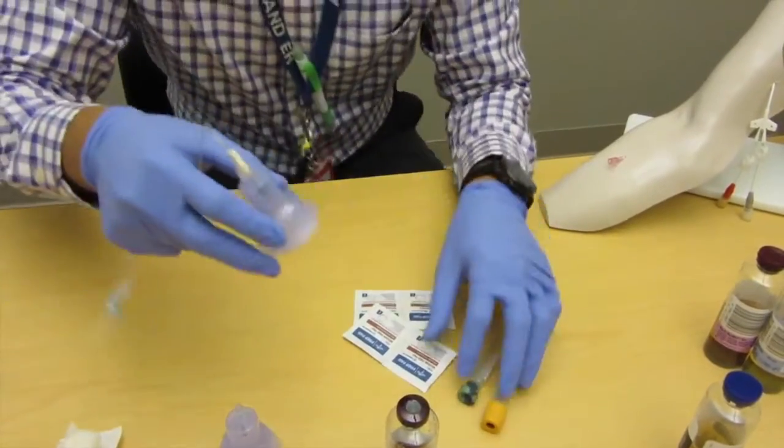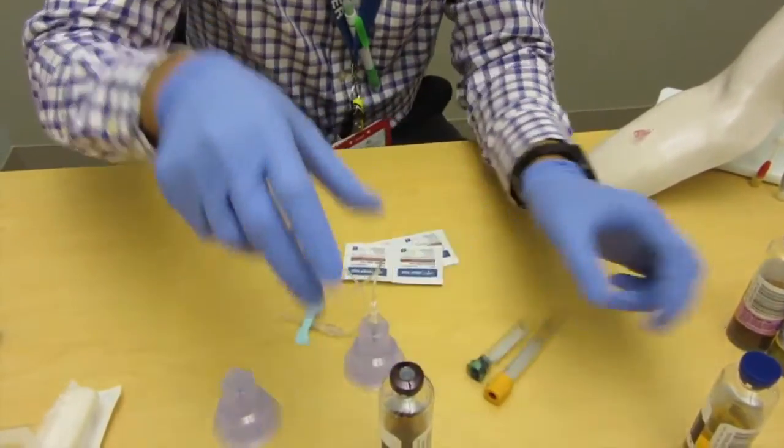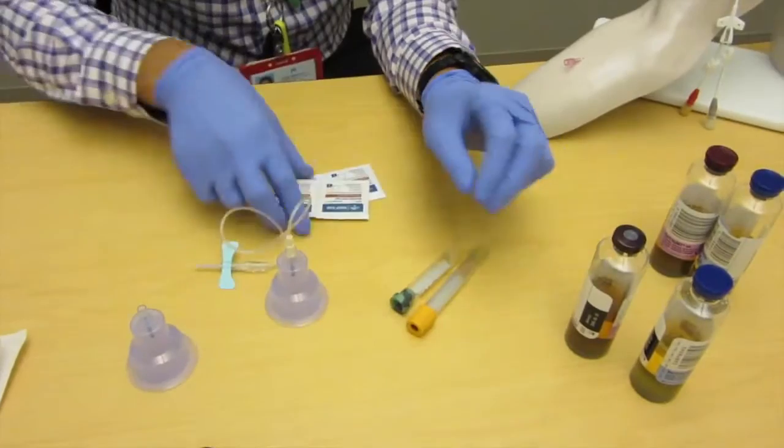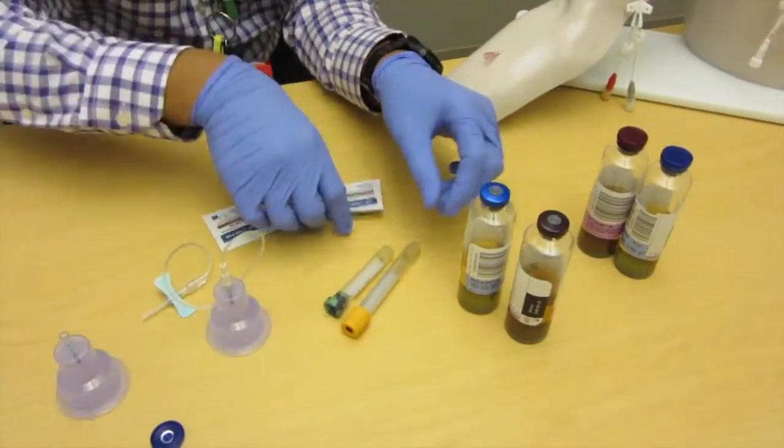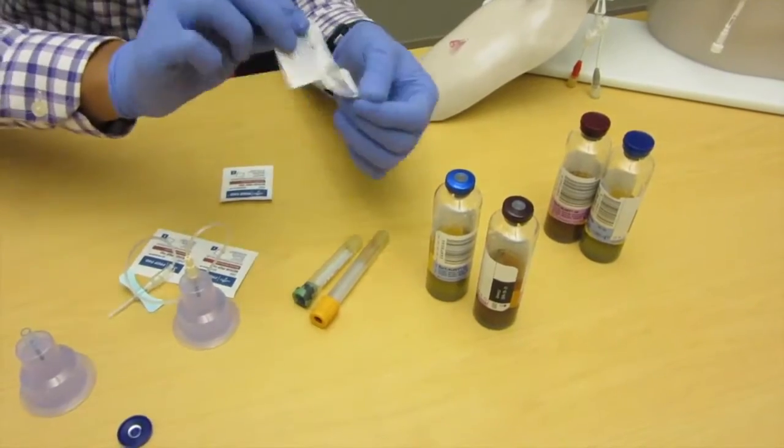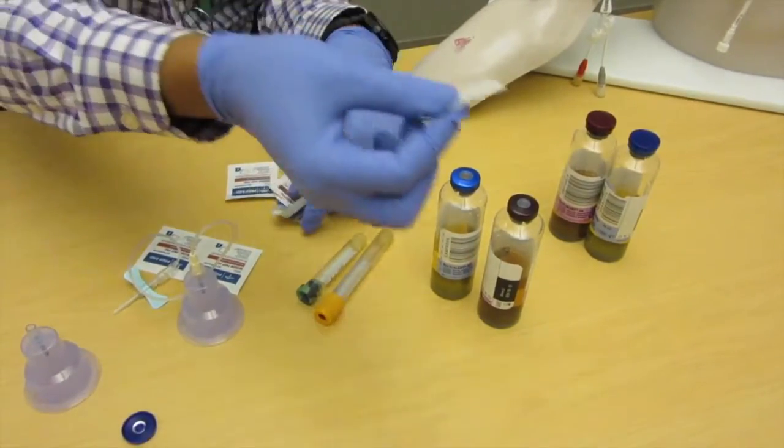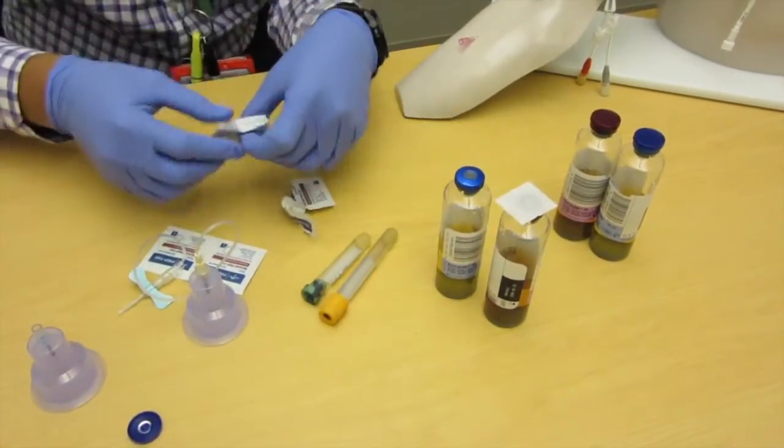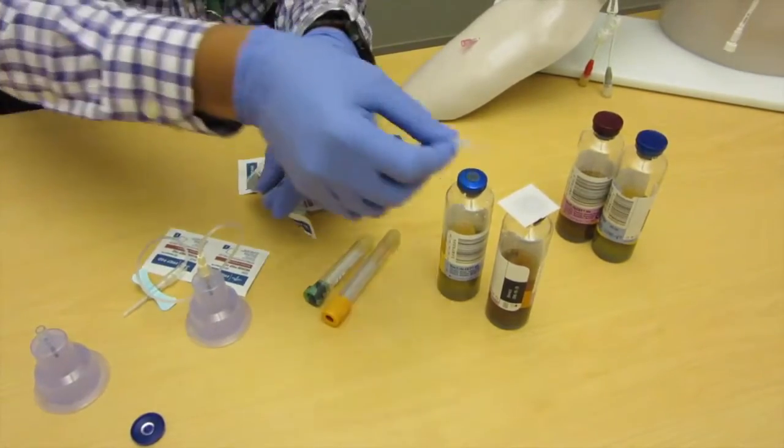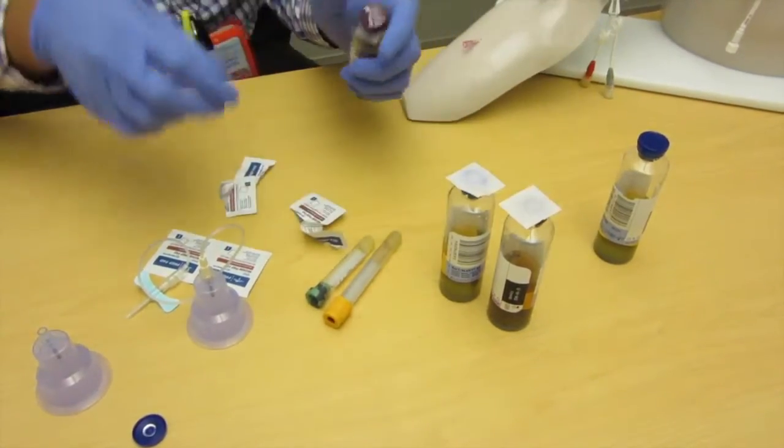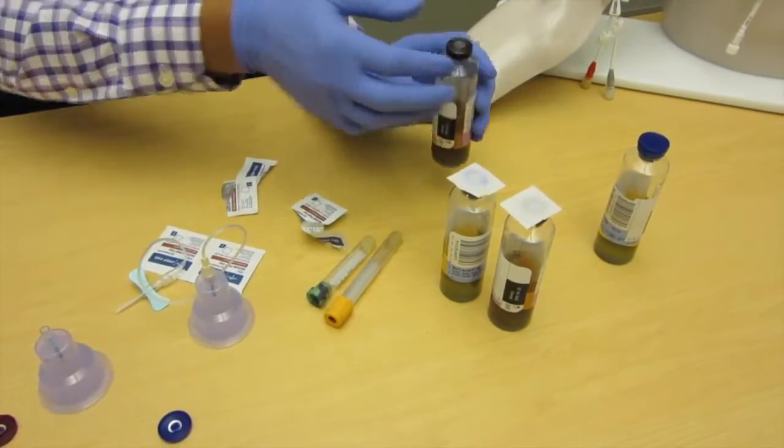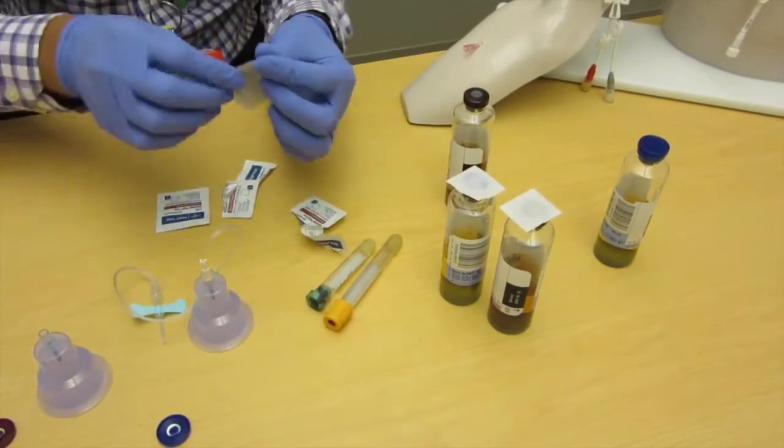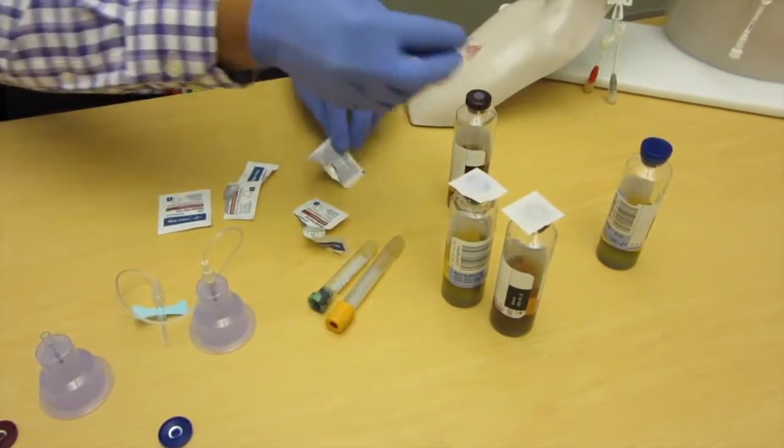Back to drawing some cultures. Another thing you want to do when drawing cultures is when you pop the top off over here, best practice is to go ahead and take an alcohol swab and just place it right on top, just to ensure that it is sterile, that you don't accidentally touch the top of this.